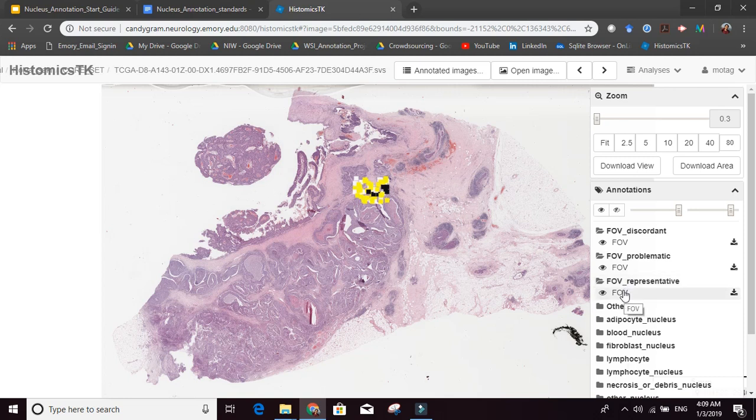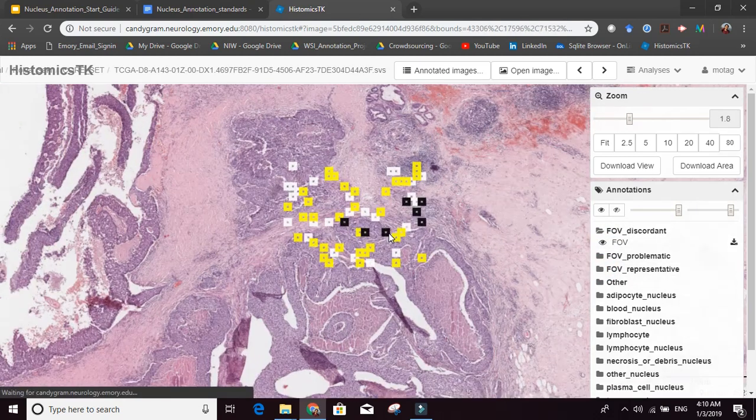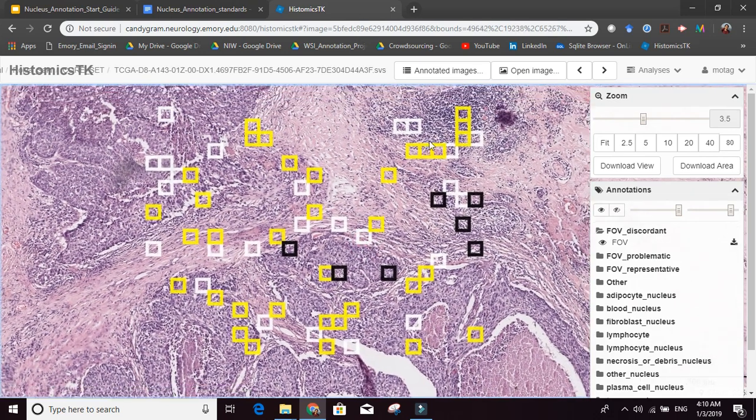It's a subtle difference, I'm not going to go into that. But after you click on this eye icon, it will show you where the different fields of view are. You can see Rukaya has maybe 25, 30 fields of view, something around those lines. These are the fields of view that Rukaya needs to annotate for this particular slide.